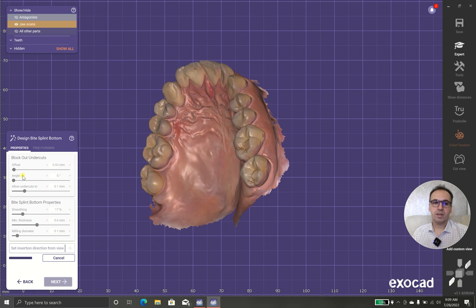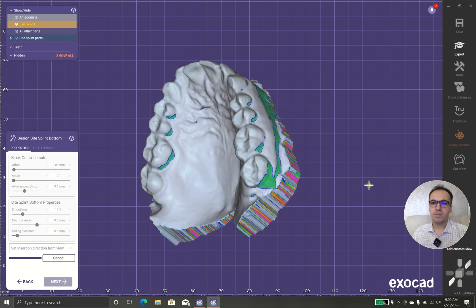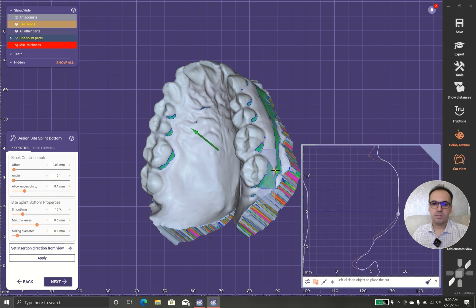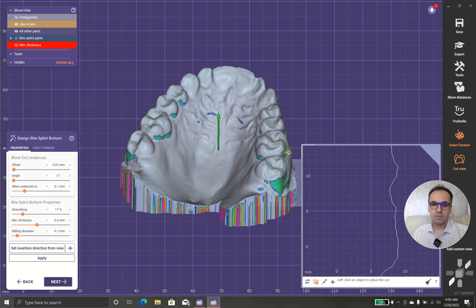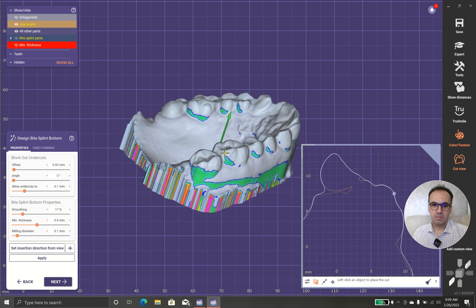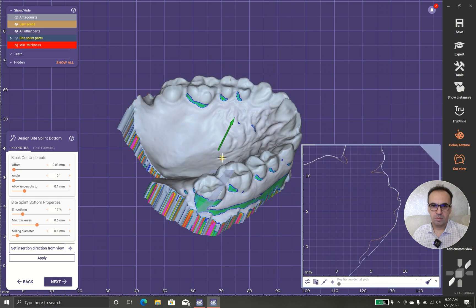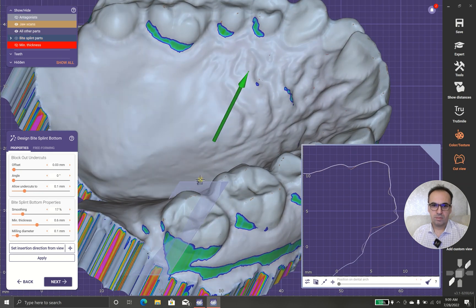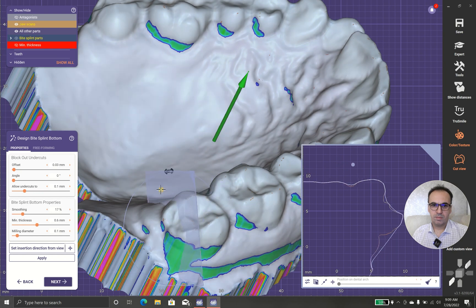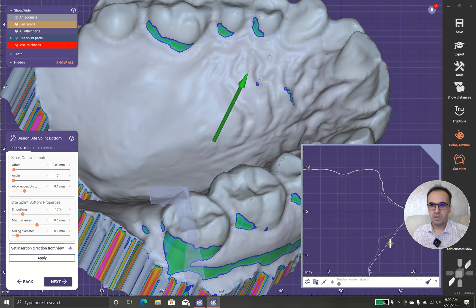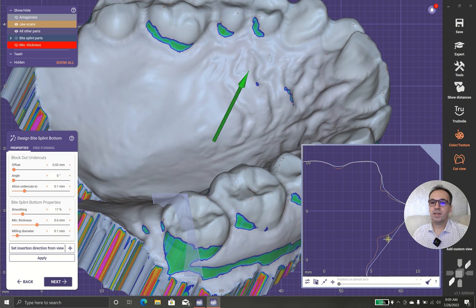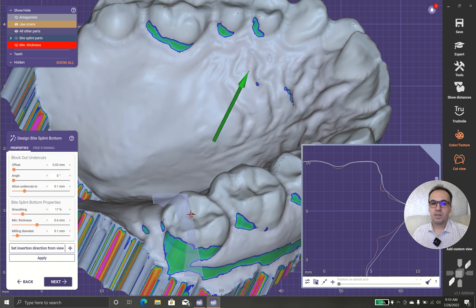As I told you before, I will talk about offset angle, allow undercut, smoothing and other things. Now, let's have a cut view. As you can see, there is a gap here.